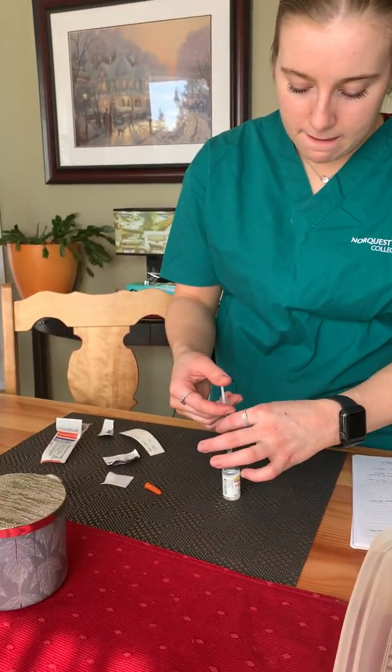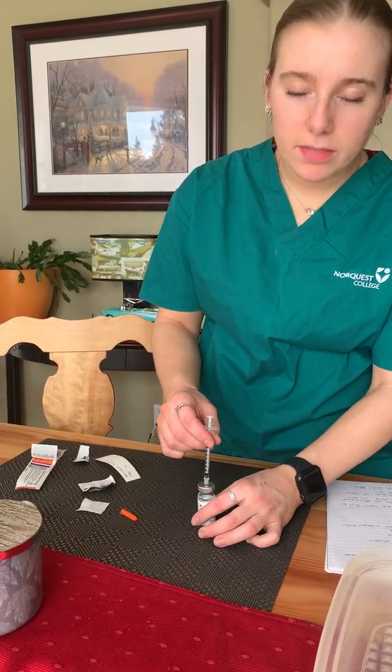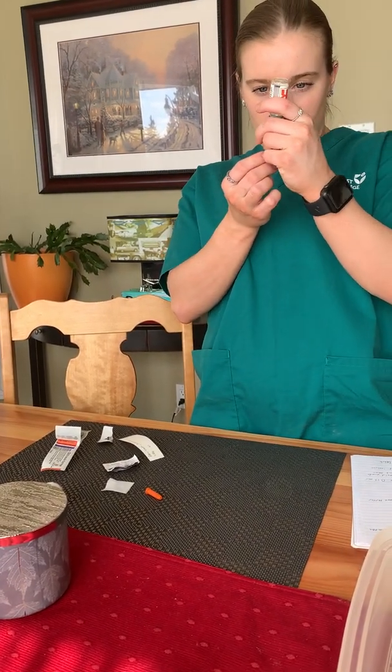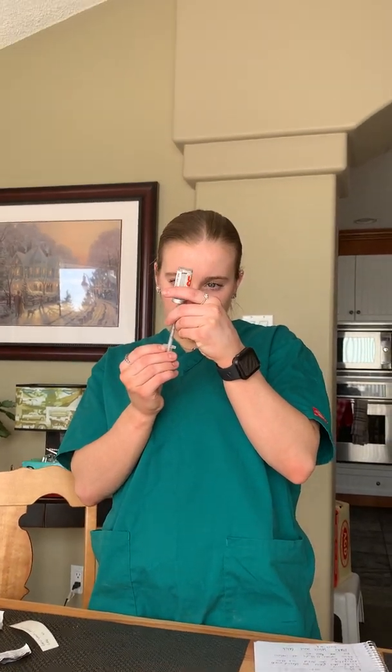And we want to ensure that we first inject air into the vial here, the exact same amount that you will be drawing. So now I can draw the medication. So we're going to be getting 0.12. We want to ensure to go slow so we do not get any bubbles into our medication or into our syringe here. 11, 12. Perfect. After that, we will pull it out, place this down here.